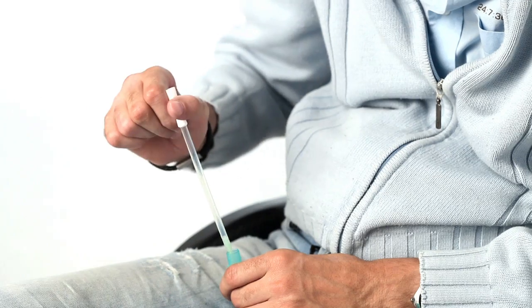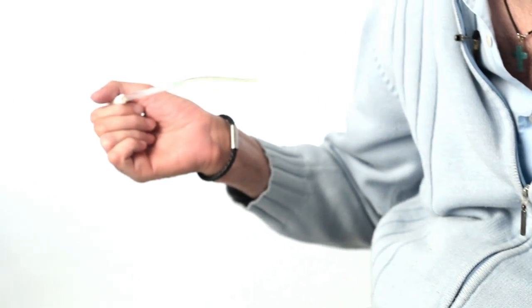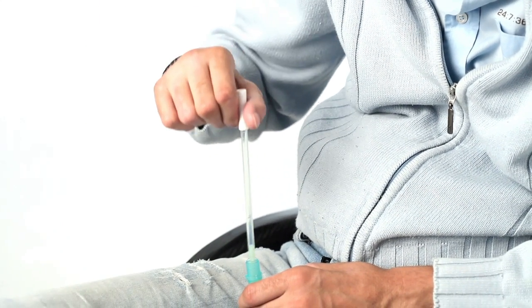I can place it between my legs, the container, and then take the catheter and insert it. Empty my bladder, put it out again and back into the container.